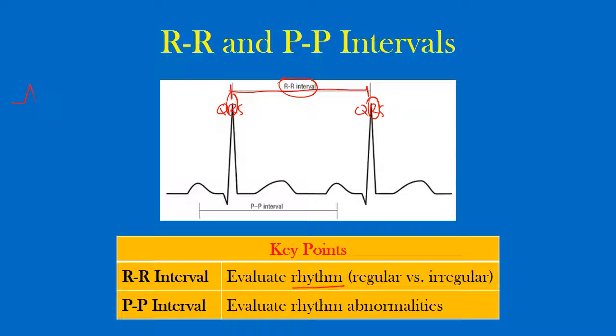So let's just show that quick. Here are a few complexes. Imagine that the distance between all of these, I know not exact, but imagine that they're consistent. Let's just label them as 1. And then we have this complex here that shows something like this. And now we can see the distance between this and this.